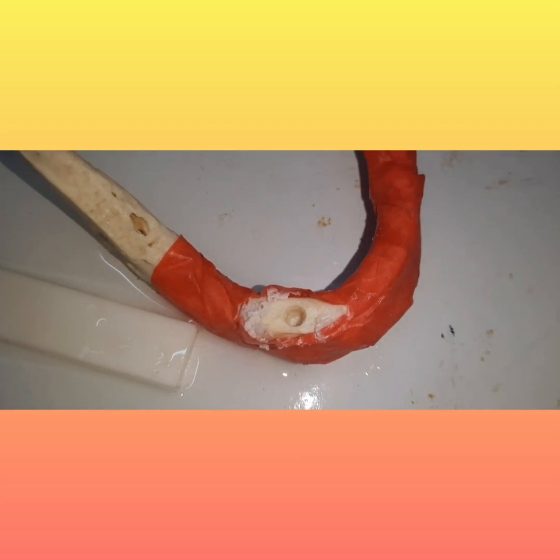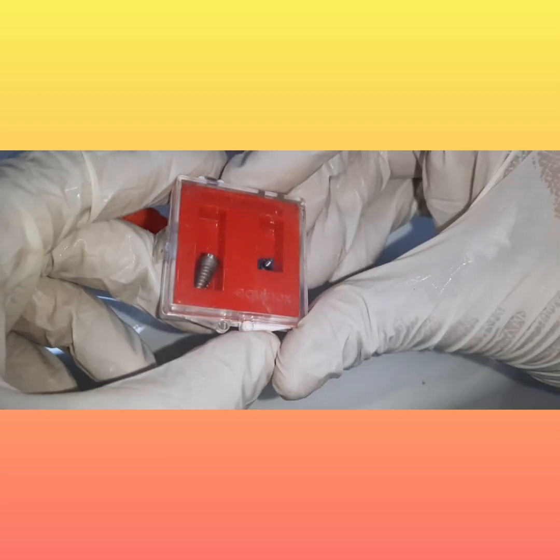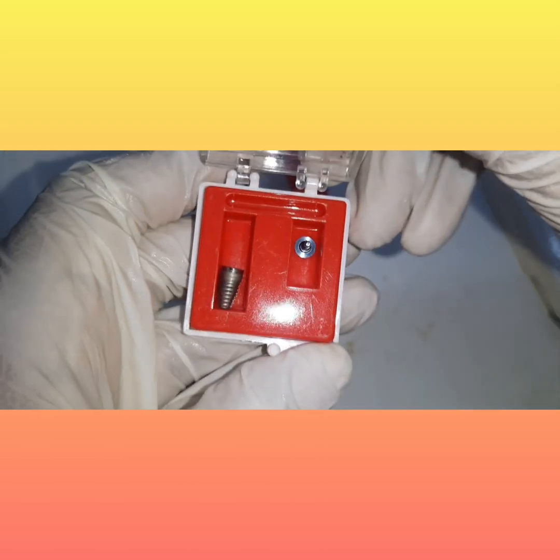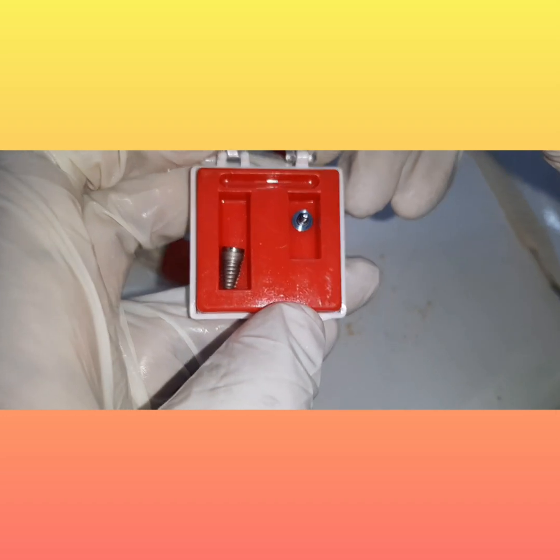So now you're going to take the implant from the pre-packed packet which is sterilized already, and you have to be careful you will not touch the surface of the implant, because then there are chances of failure for that. So you have the implant like this. You're going to open it up, and this is just for demonstration purpose.